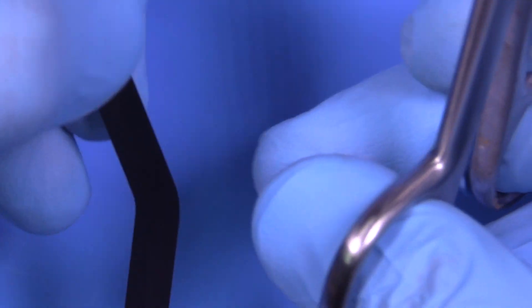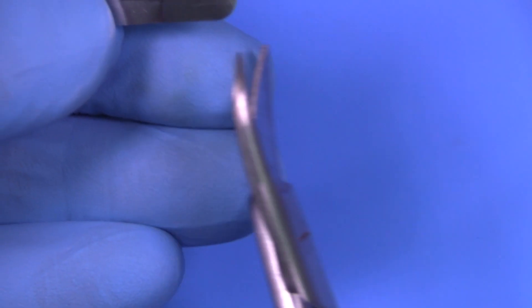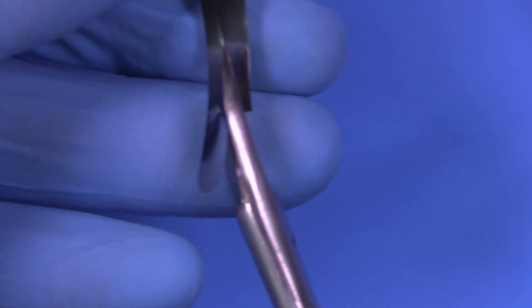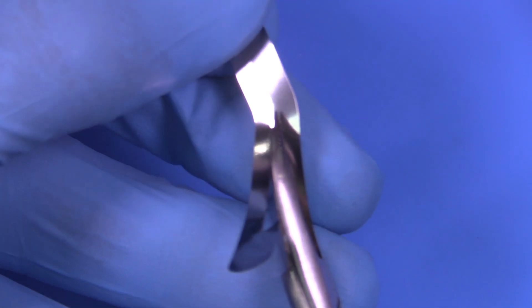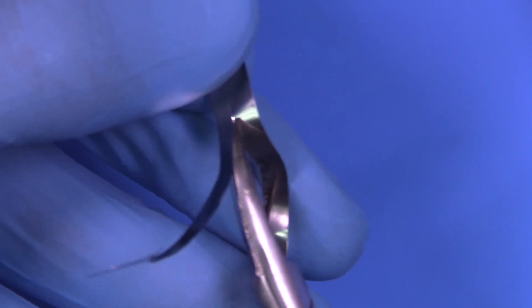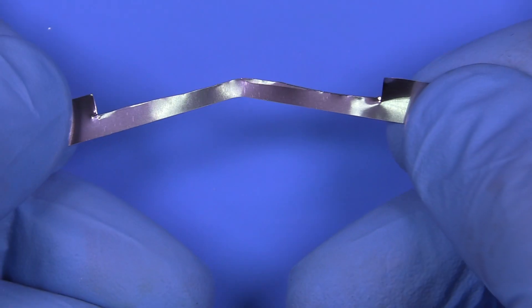We just cut the top off with crown-and-bridge scissors — really easy to do. You can buy these commercially; Garrison Dental Solutions has excellent bands that have been designed for this purpose. I've been making these for about 25 years and thought every dentist would want to make them to customize the situation — whether thin, thick, or in between. The key is you want to thin it so that it fits tightly around the neck of the tooth, around the root itself.